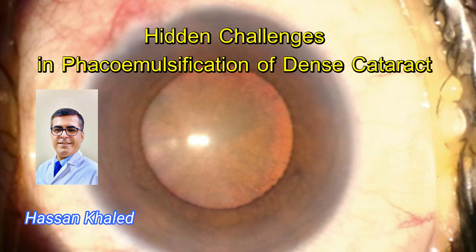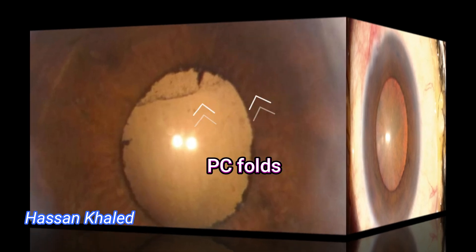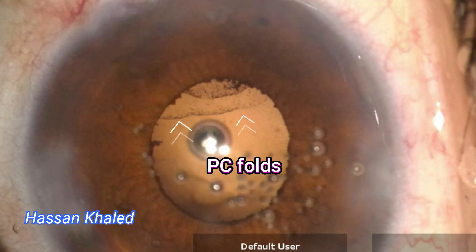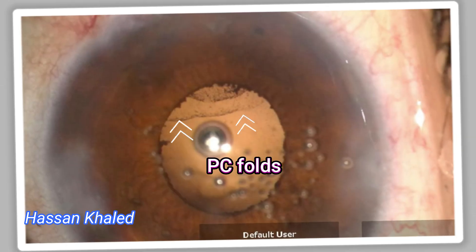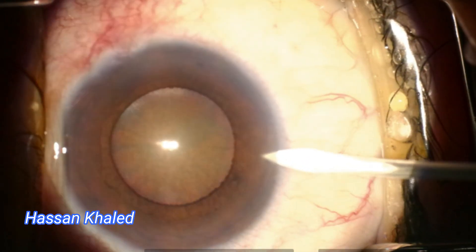Here is the case of phacoemulsification of a very dense cataract. What I noticed upon removal of the cortex were posterior capsular folds or wrinkles. What are these folds and what's behind them? Let's watch this case together.